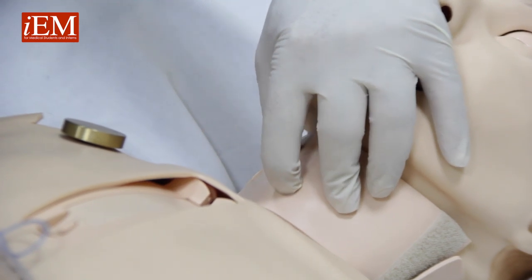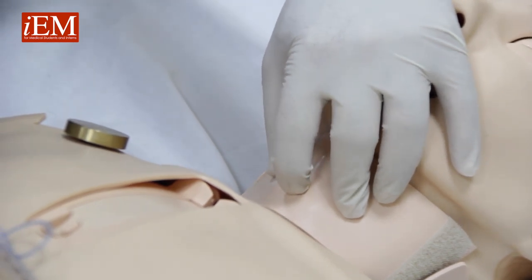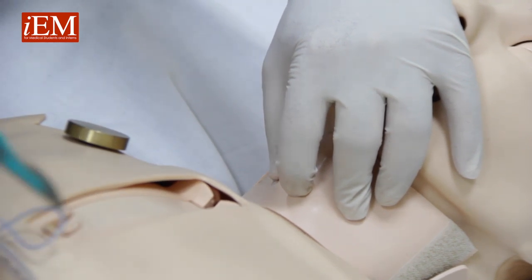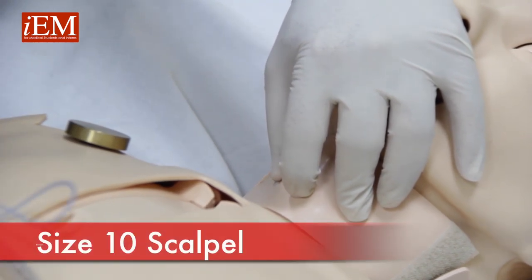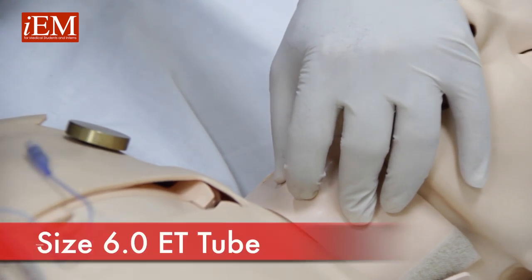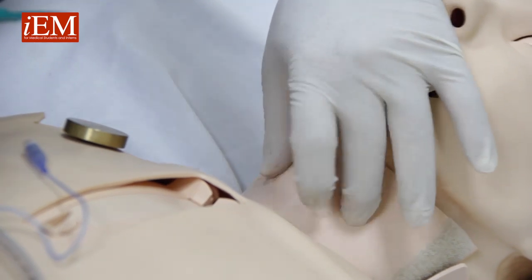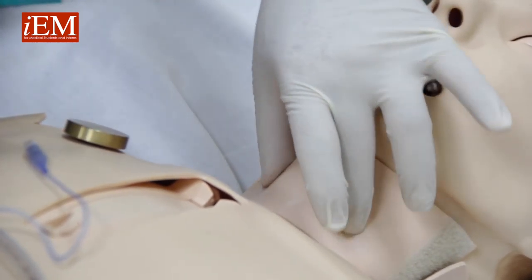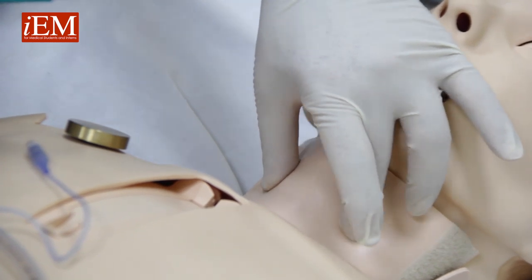We're going to do a surgical airway using minimum equipment: a Kelly, a size 10 surgical blade, a size 6 endotracheal tube, and a 5cc syringe. You start by locating your cricothyroid membrane, putting your trachea between your thumb and index finger.